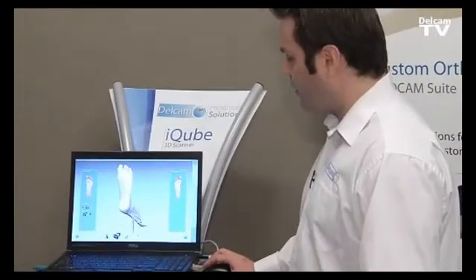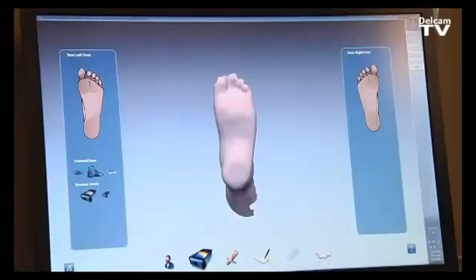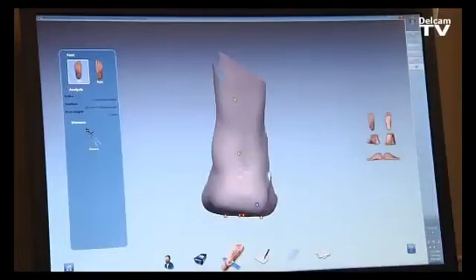Once the software creates the 3D image of the foot, we can evaluate and check it. The doctor or practitioner can click on the next icon to start aligning the foot to the ground and identify the first metatarsal head, the fifth metatarsal head, and the heel point that will be used at the lab to design the orthotic.